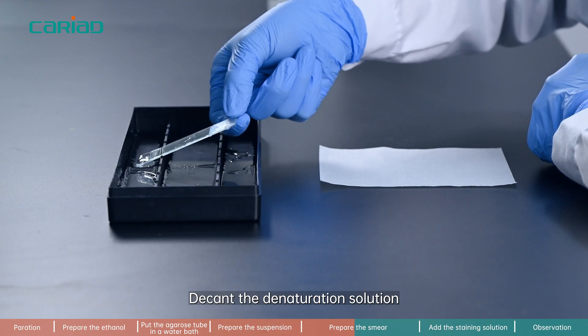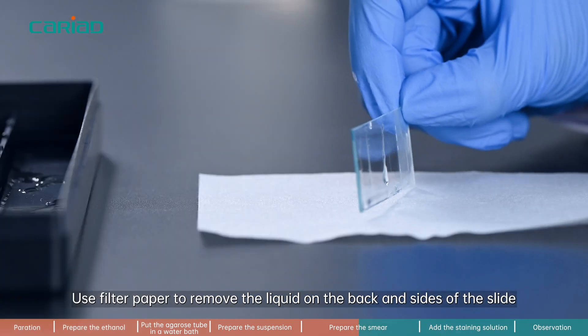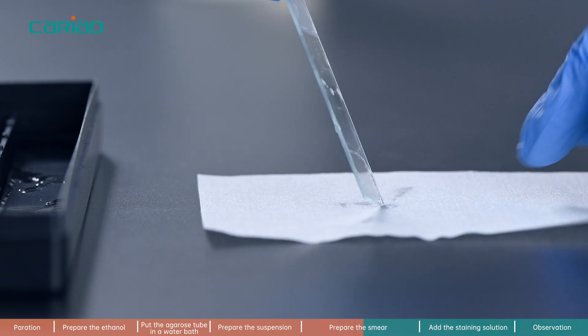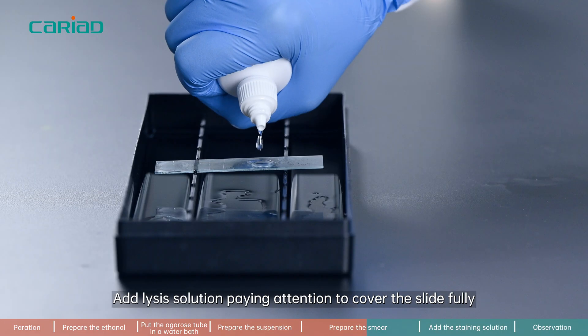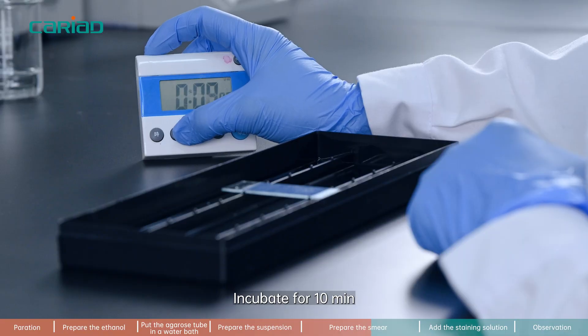Step 7. Decant the denaturation solution. Use filter paper to remove the liquid on the back and sides of the slide — do not touch the specimen area. Add lysis solution, paying attention to cover the slide fully, and incubate for 10 minutes.